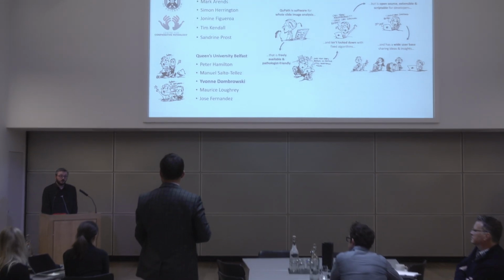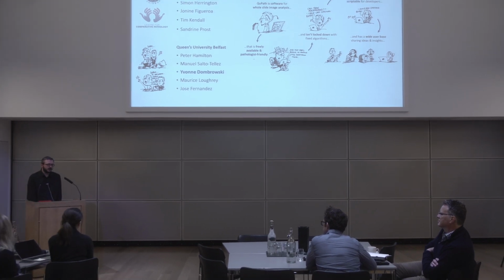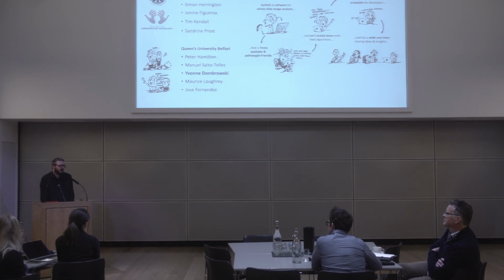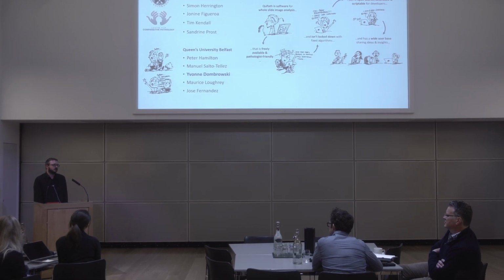One of the small benefits of being the only person really behind this is I could make the brutal decision to switch to Java 11. So now it's at Java 12, and so I've already made that leap. And so I'm kind of away from the Oracle Java.